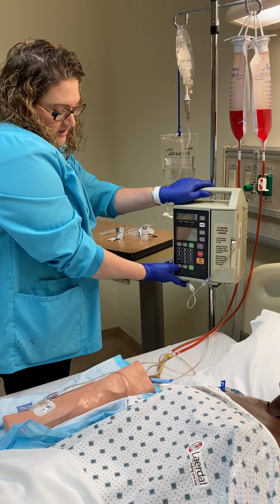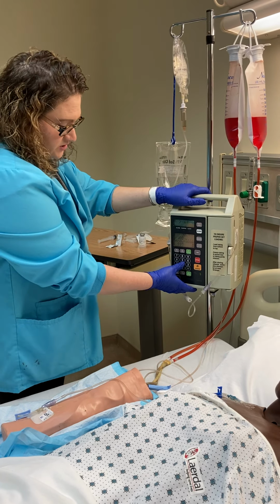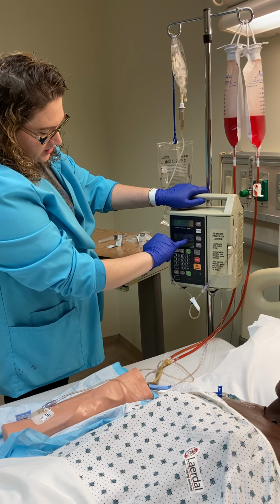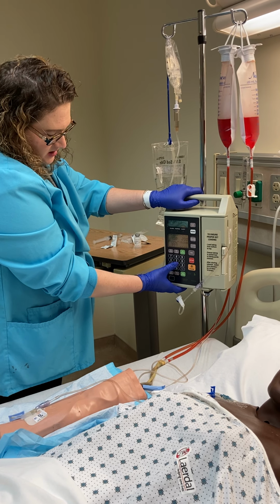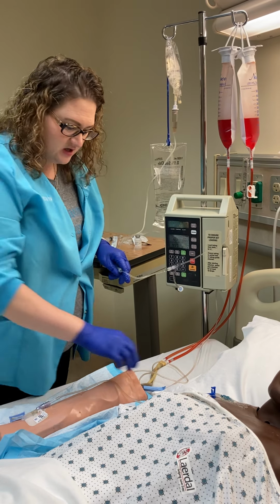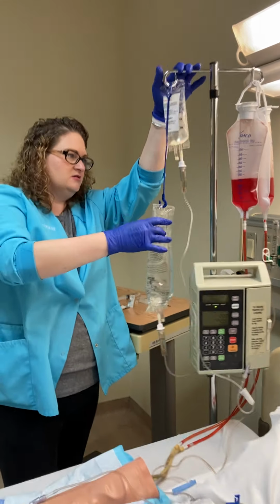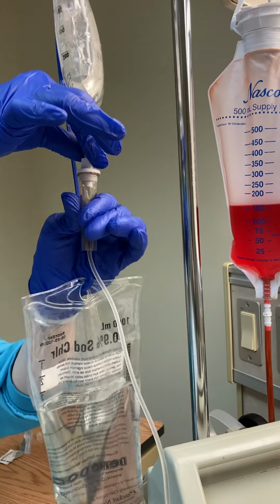Now I'm going to go to secondary rate and this is going to be for the vancomycin. And I said we were going to do 200 mLs over 1 hour, 60 minutes. So I have 200 mLs per hour in the first one. Then my volume to be infused, VTBI, is 200, which is the whole bag. I make sure everything is nice and unclamped, and it is. And then I'm going to hit secondary start. And what I should see is drops up here in this chamber.